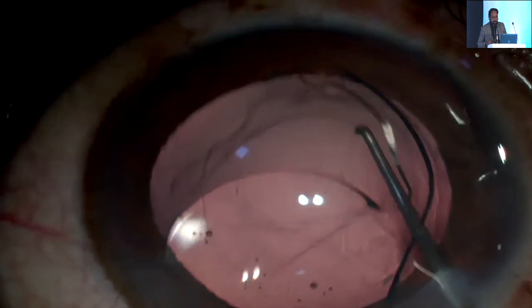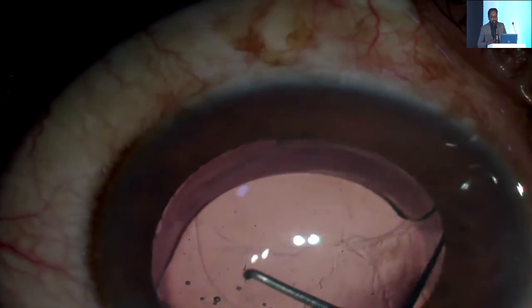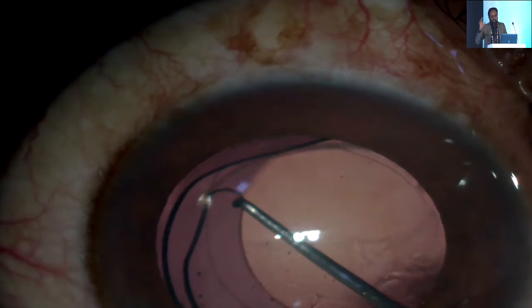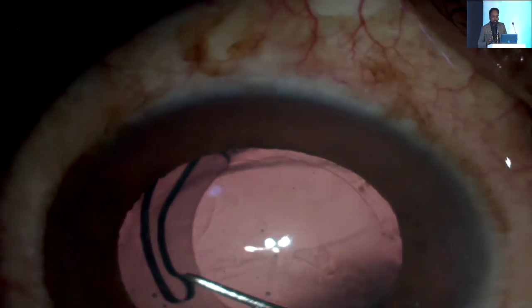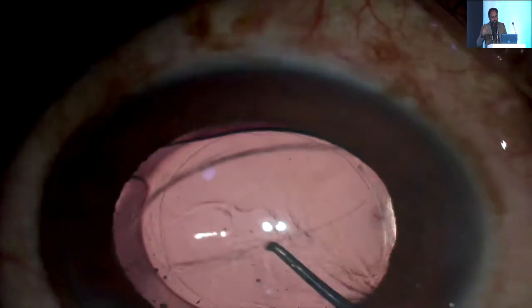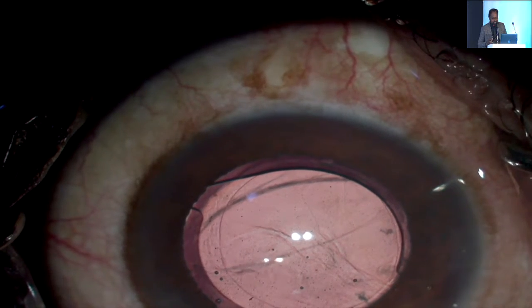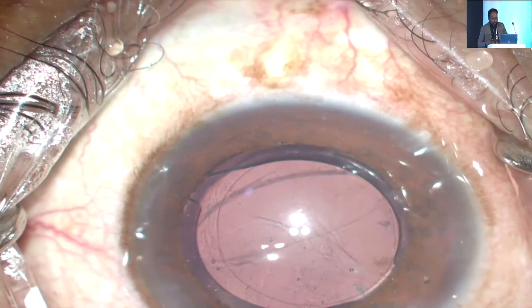And sometimes I avoid doing too many maneuvers or trying to expand the entire thing and doing it again. So I wanted to just make sure I could keep the lens in the bag. As long as you can see the ends of the PC tear, you know there is no further extension. You can always use the same single piece lens in the bag beautifully. You just make sure that you are able to see the margins of the PC tear. I always learned that a PC tear is actually a safer thing than having an anterior capsular tear. So you can manage it.